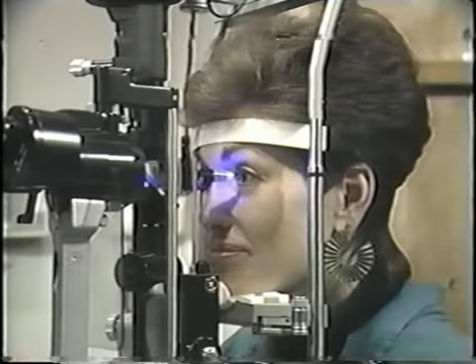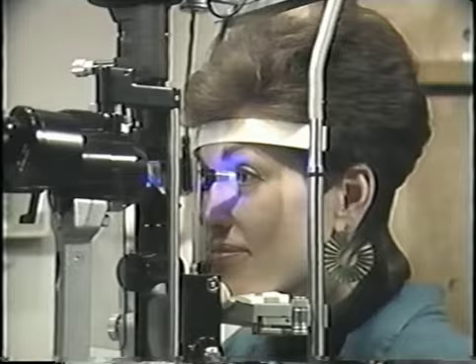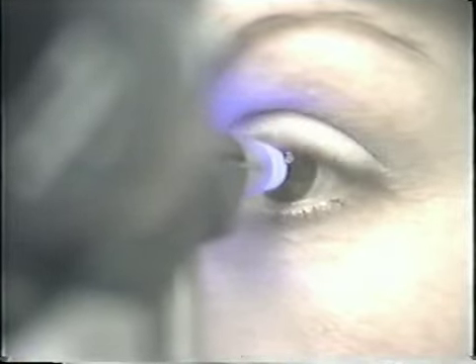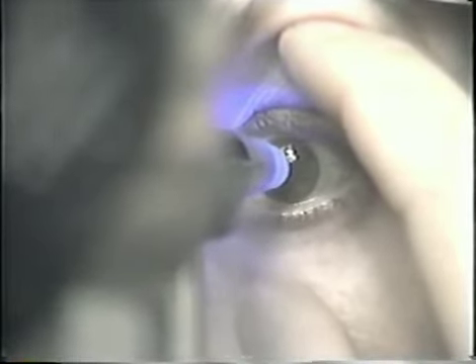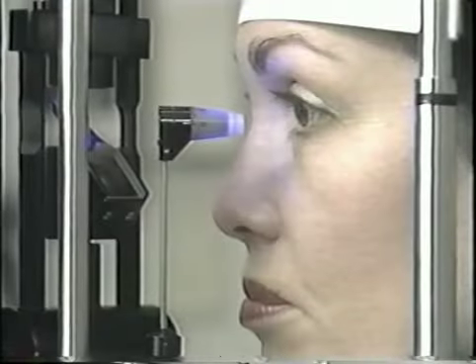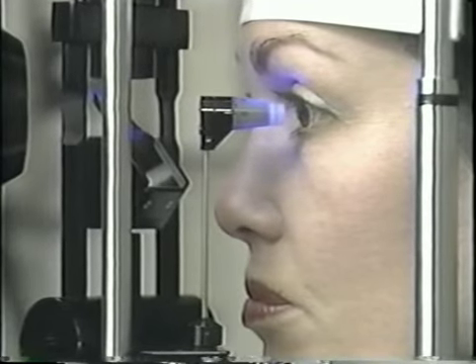The eye should fixate on a target away from the tonometer. It is important that patients not hold their breath. Rather, they should try to be as relaxed as possible. The lid should not touch the tonometer. If necessary, the examiner can manually keep the lids open, making sure to apply pressure to the bony orbit and not the globe. The slit lamp is moved to approach the cornea along the optical axis.